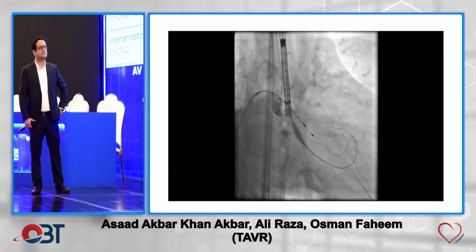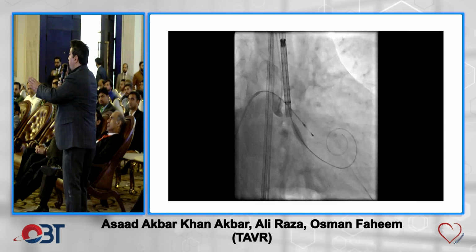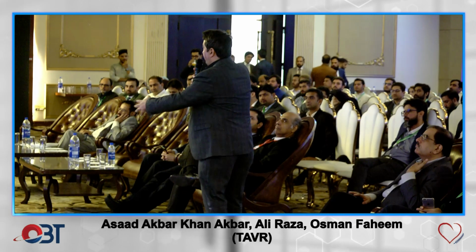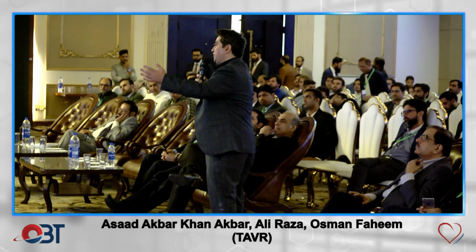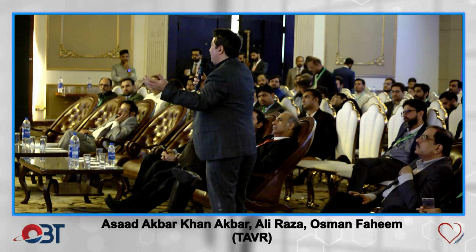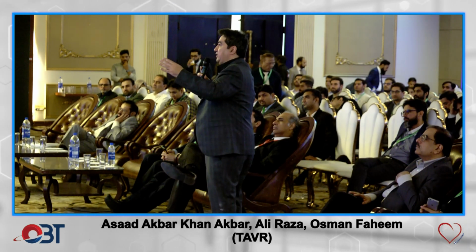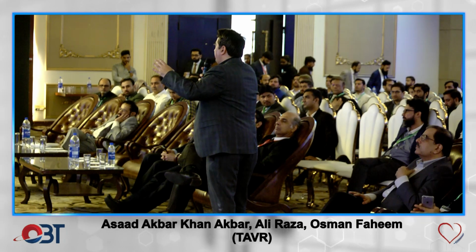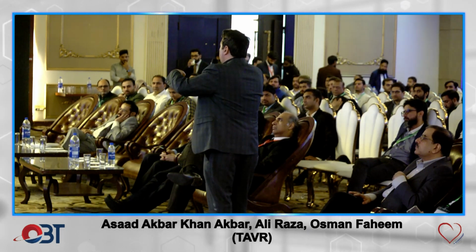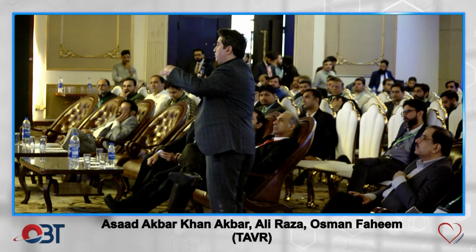So I think the wire is, yes, I control the wire as I go in it. So I push and pull according to that, actually. I keep it in an appropriate position at the beginning. And then, because this was with the old valves, I think the new valves don't move that much anyway now. And probably the FX, the new version of this Medtronic, doesn't move at all, actually.